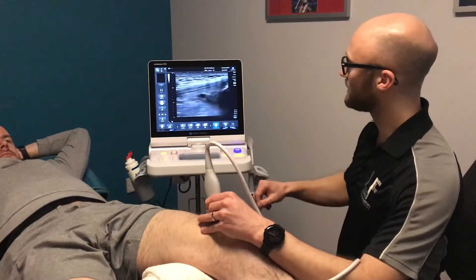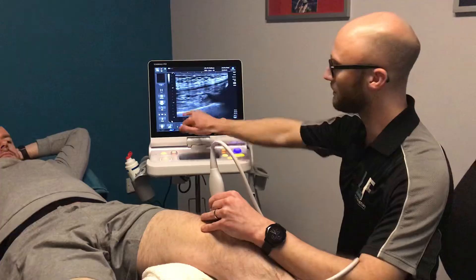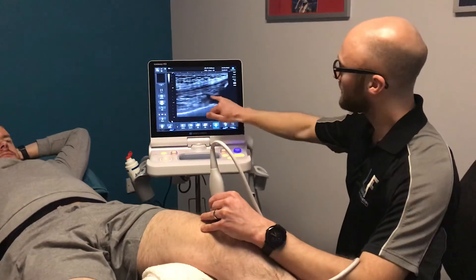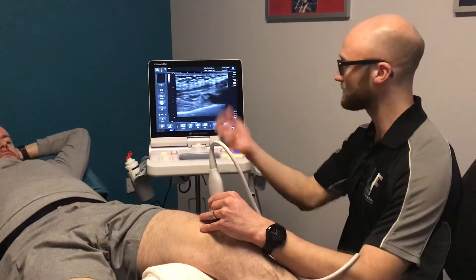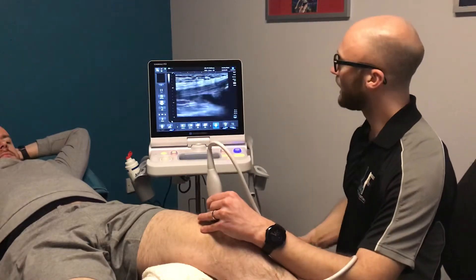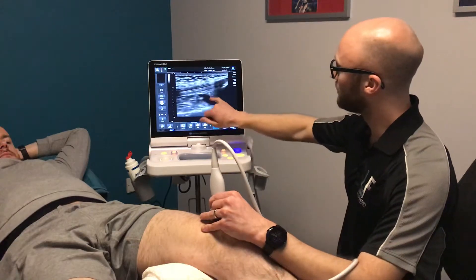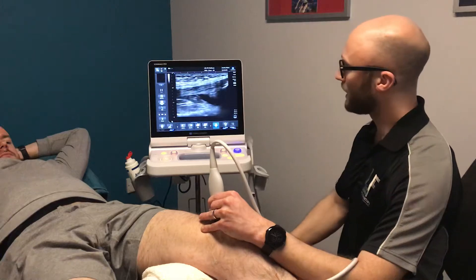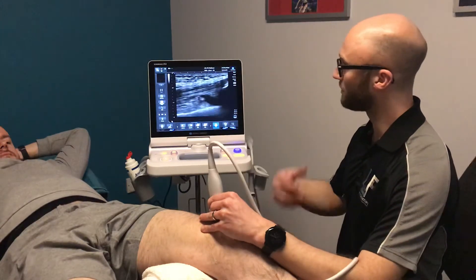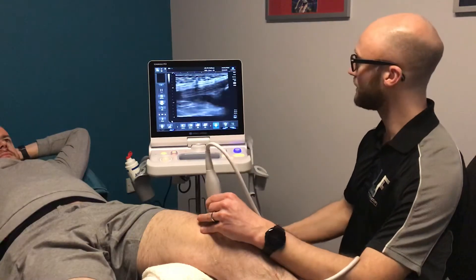We can see down into the knee a little bit deeper and here we have the femur, the bottom end of the thigh bone. In this area you can see into the joint space itself — the knee joint has a capsule that goes round about it and we can see the capsule very nicely. There's a small amount of fluid within the knee joint here and that can often be quite normal. In the presence of problems within the knee joint, sometimes you see an awful lot more fluid.